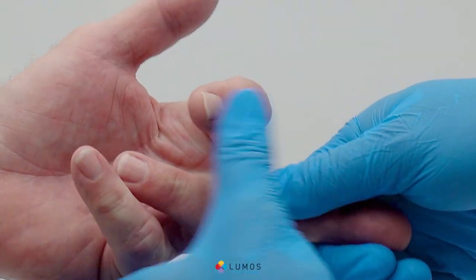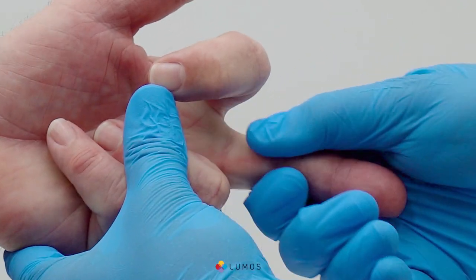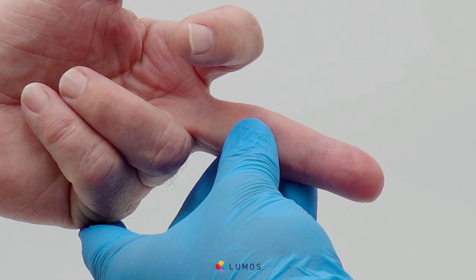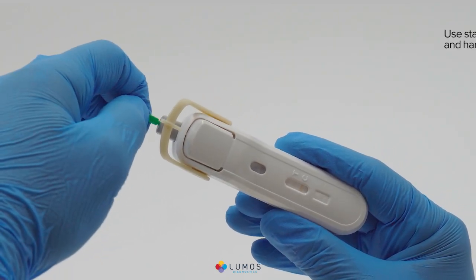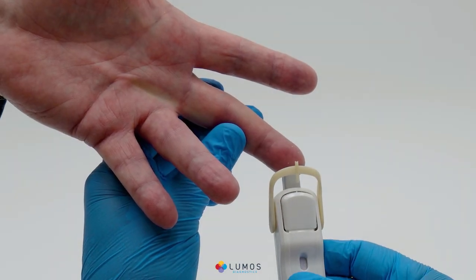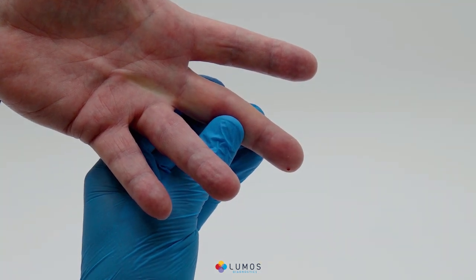Select a finger and massage from base to tip. Cleanse the fingertip with alcohol. Twist the protective lancet tab 90 degrees and pull to remove. Firmly press the lancet against the patient's finger to puncture the skin.